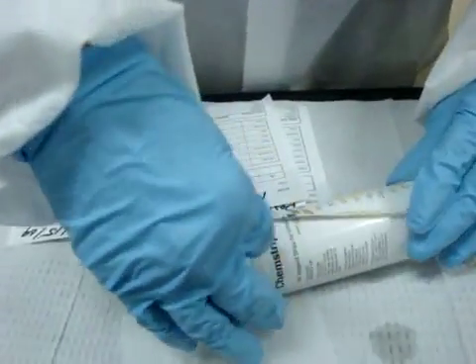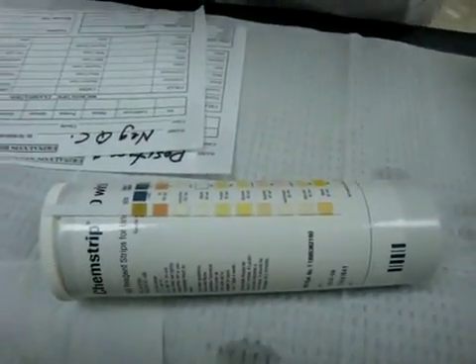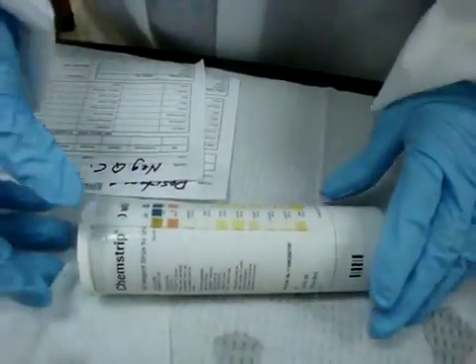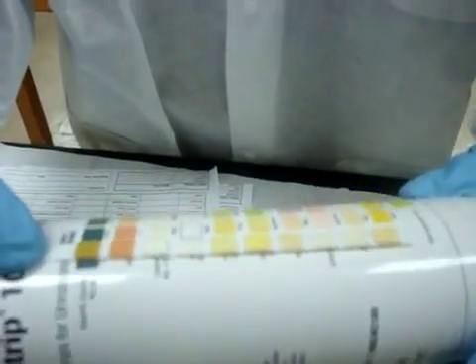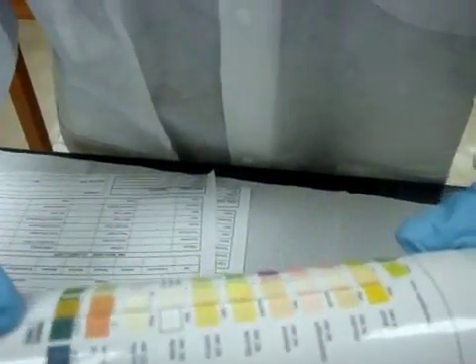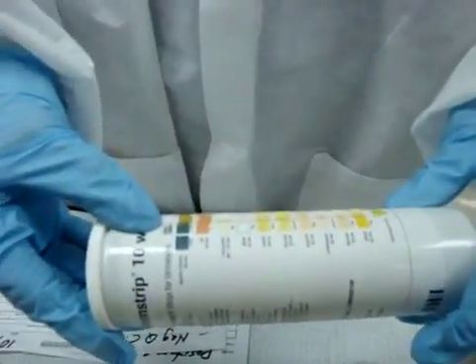Then I can lay my stick along the reading table on the back of the chem strip. Now, we do not read specific gravity with the Chemstrip, so we ignore that one. And the first one is we have to wait 60 seconds, and then we can begin to read.